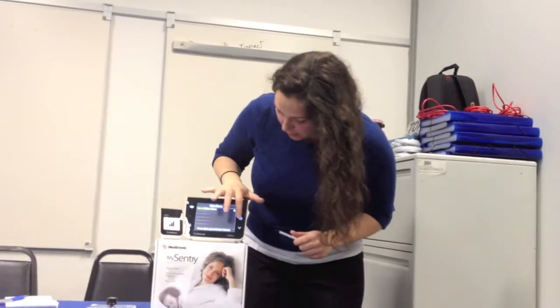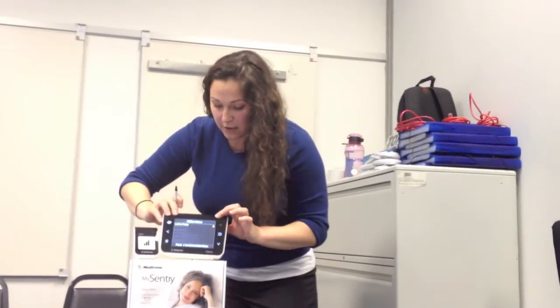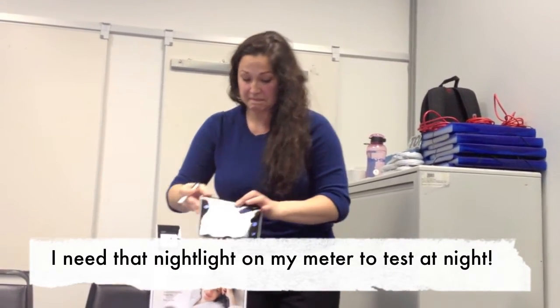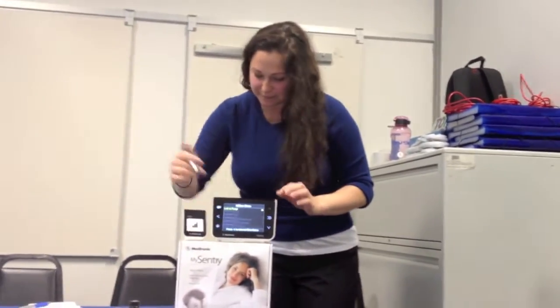Whenever you go to your utilities menu, there's a bunch of different things you can do. You can link to the pump. If we were using the outpost, you could actually link the outpost. You can edit that user info, so what that person looks like and the initials. You can adjust the nightlight brightness. There's a nightlight on the back of here, and the button's right here, and there's a nightlight here. You can actually adjust how bright that nightlight is. Nice. You can turn that on and off. We appreciate the night lights. It's right here.